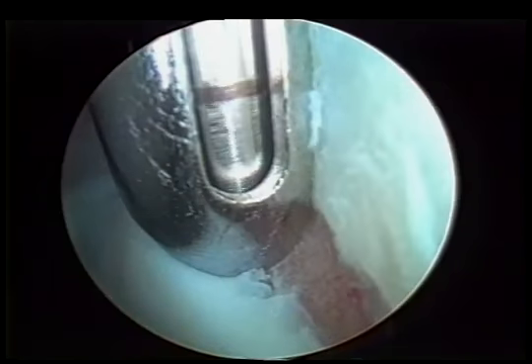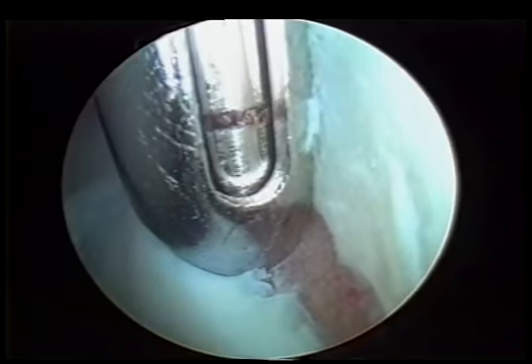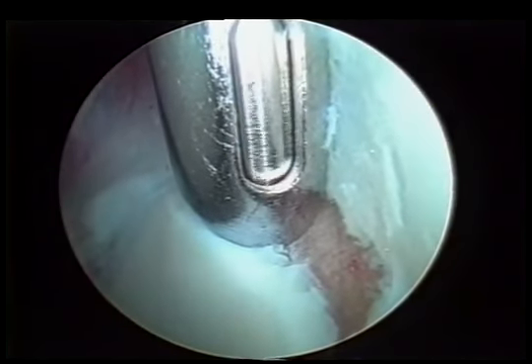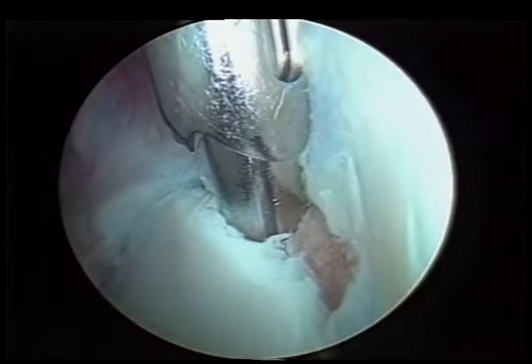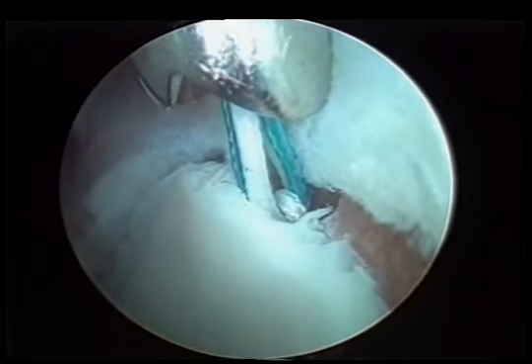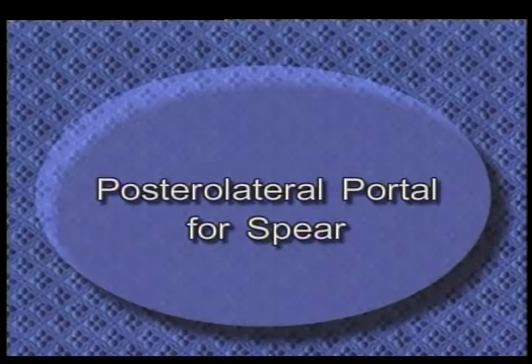Next we bring in our BioFastTech, which is a PLA biodegradable anchor that has an eyelet of suture that's molded into the body of the anchor. We'll screw this down until we feel resistance. The laser mark of our inserter is just below the level of the bone, and you see that we have this doubly loaded with two sutures.